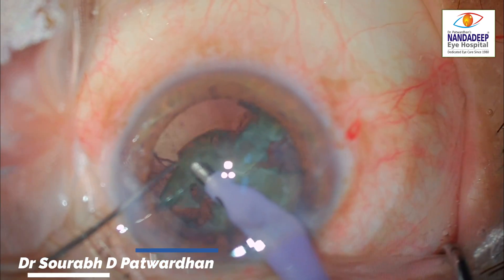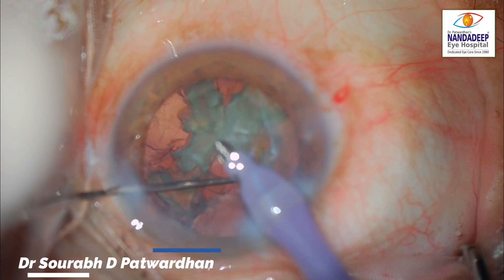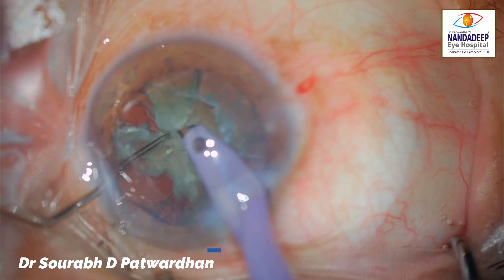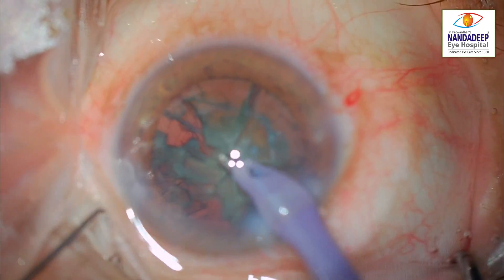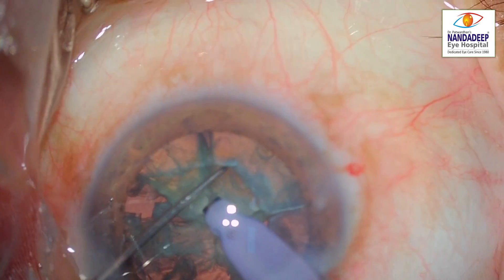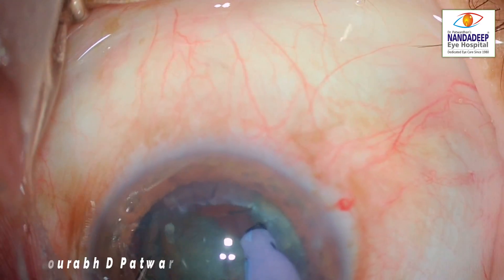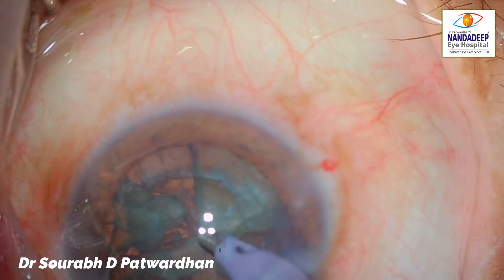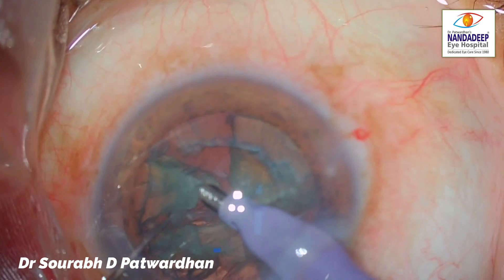Now he is trying to remove one half. You can see it is attached in the center — all the pieces are attached in the center, and that is why he is having difficulty taking out the pieces from the bag. They are getting stuck, attached to each other. The trainee does not have any free piece. He realizes this and tries to divide further, releasing one piece free of the others, and now will attempt to emulsify it.